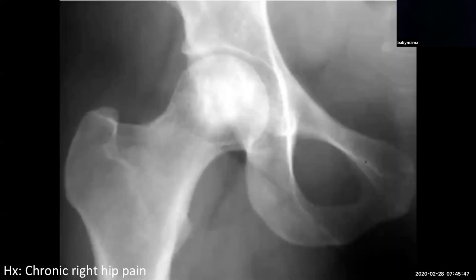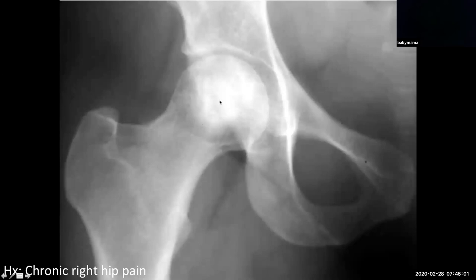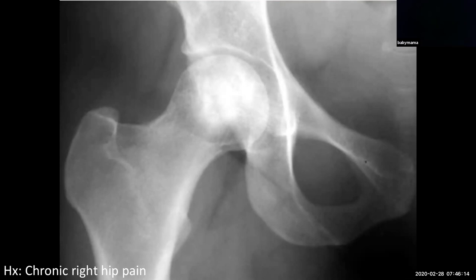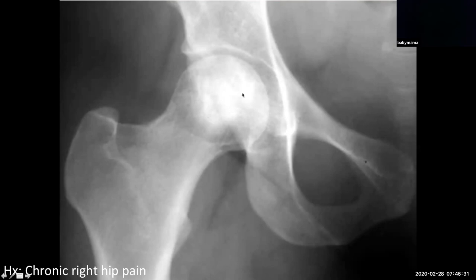How about this case? The alignment is good, the cortices are good, but what we notice is subtle sclerosis — abnormal bone mineralization — extending beyond not only the anterior wall but the posterior wall of the acetabulum. With additional history of autosplenectomy and acute chest pain syndrome, and recalling that this person's vertebral bodies were H-shaped — this is a case of avascular necrosis in a patient with sickle cell disease. We can appreciate this subtle bony sclerosis or abnormal bone mineralization of the femoral head without collapse or secondary degenerative changes yet.